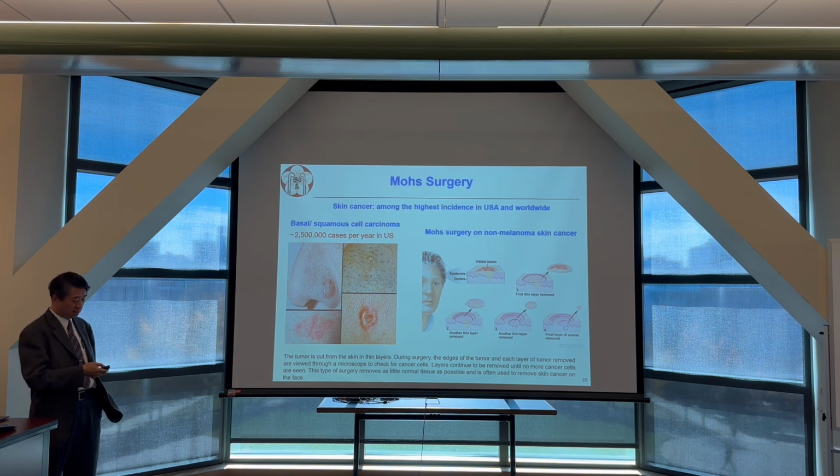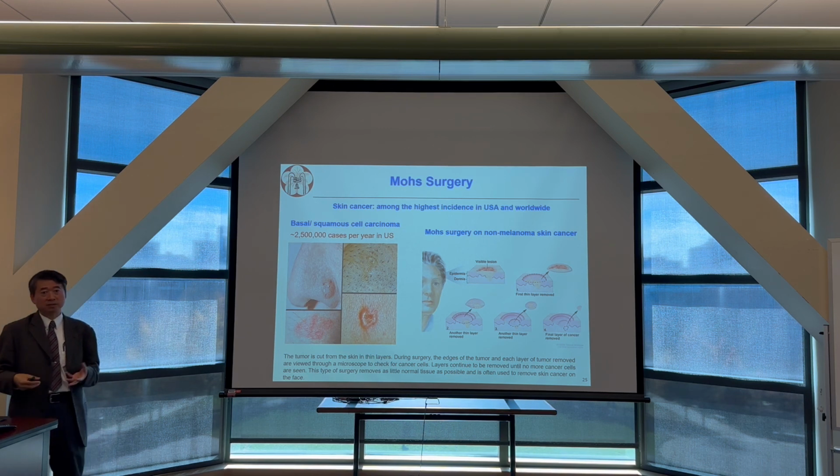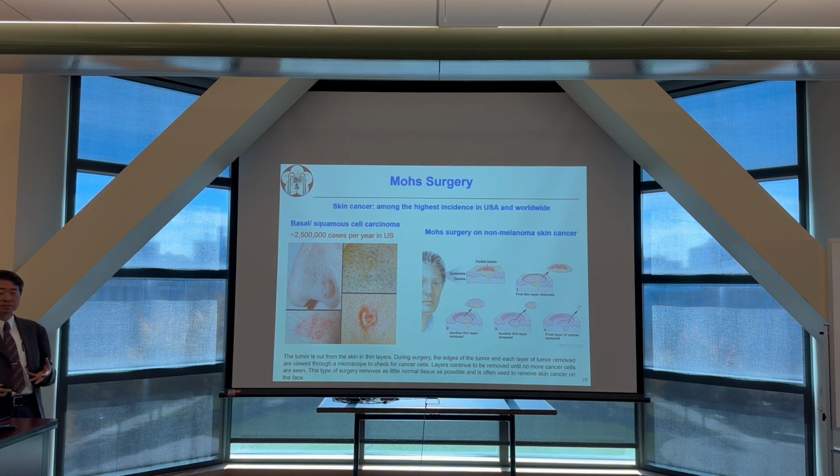But in case the tumor is on the face, you also want to reduce the amount of incisional biopsy. So the best solution is to accurately determine the boundary between the malignant tumor and the benign tissue. Using OCT, we can try to see whether we can determine where the boundary is.